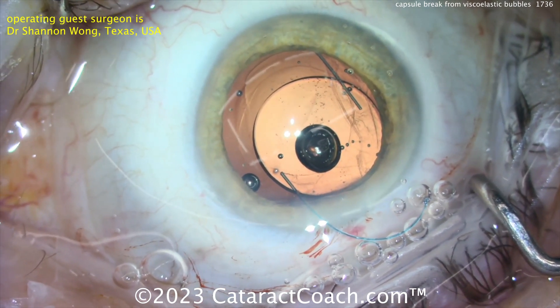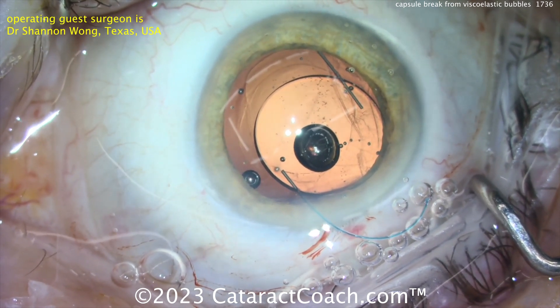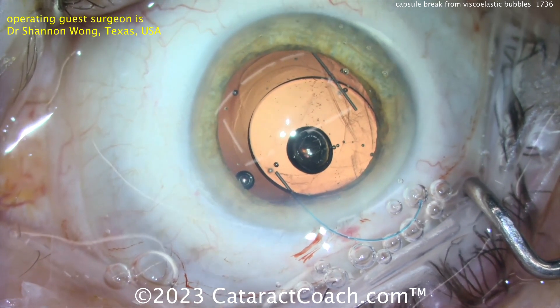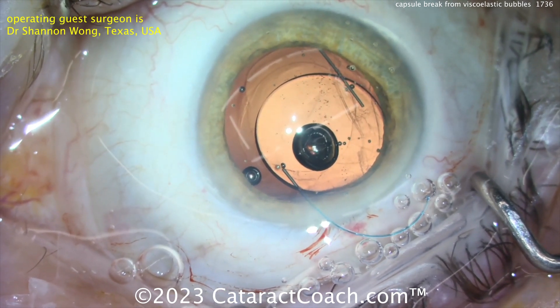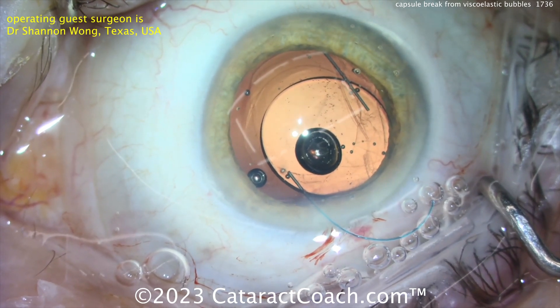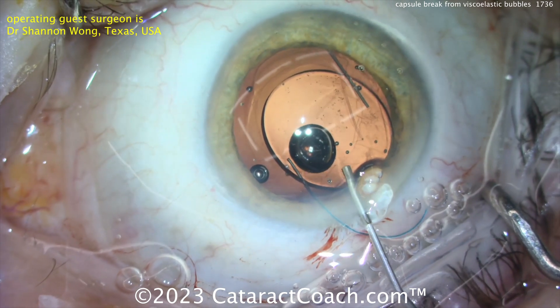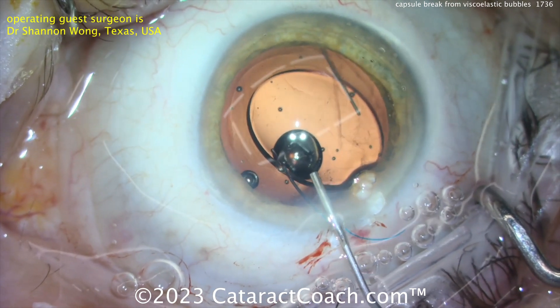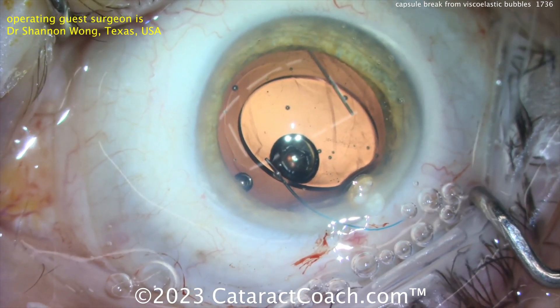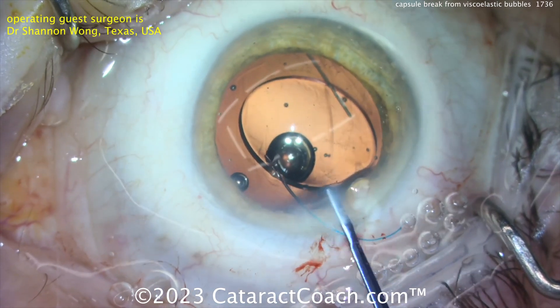You have to remember the posterior capsule is only about four microns thin — very fragile. In a case like this, you really want to be careful: if you see bubbles coming out, slow down the injection. This couldn't have been predicted — Dr. Wong says he's used this viscoelastic for 25 years and tens of thousands of cases, and these are the first two times he saw it happen.